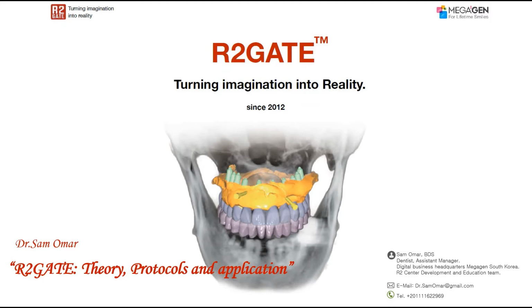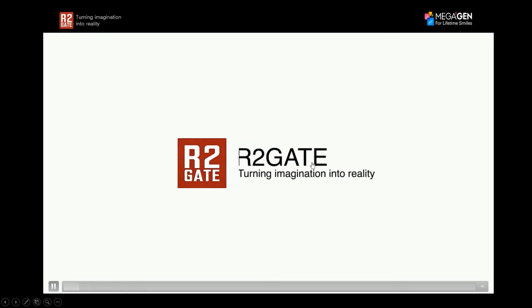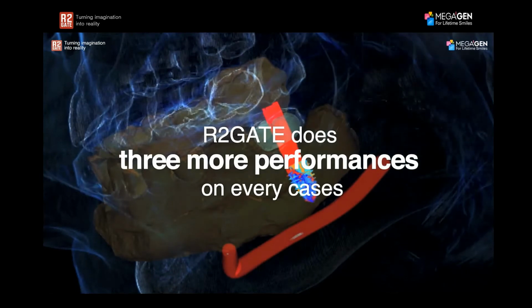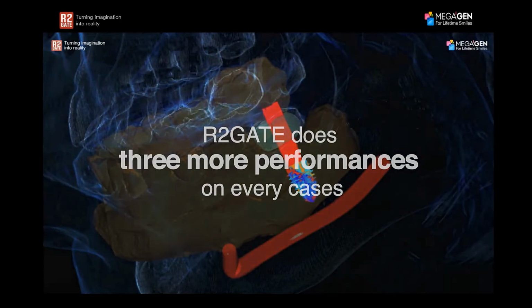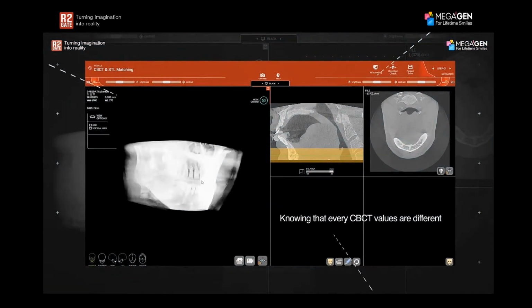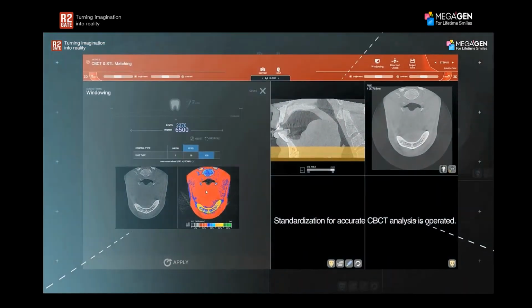Today, my topic is going to be the R2GATE theory, protocols, and application. Let me go ahead and start by giving you just a brief introduction about R2GATE. R2GATE software has been there since 2012, and the way R2GATE software really started was using it as software to match the models to the CBCT, and that was pretty much it.